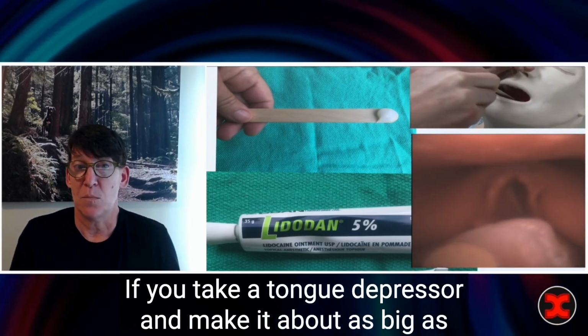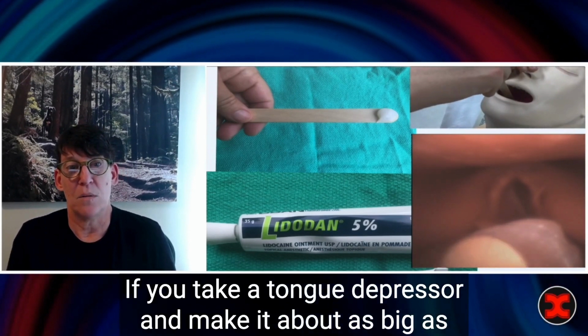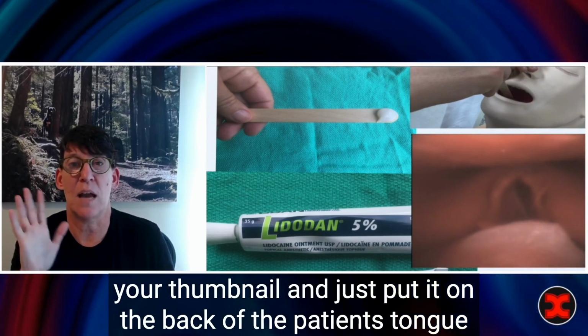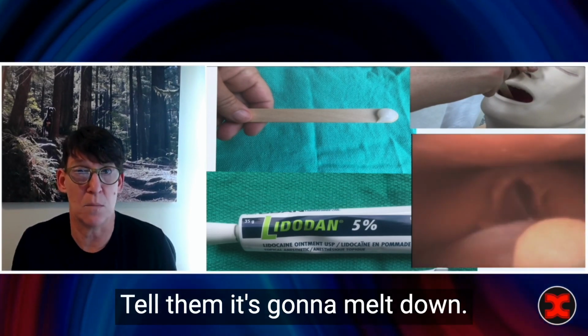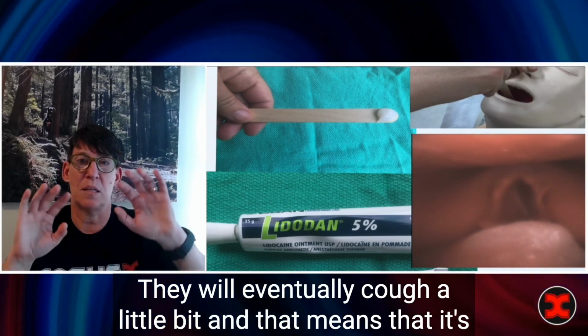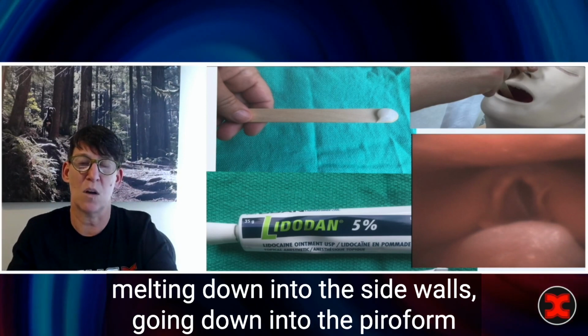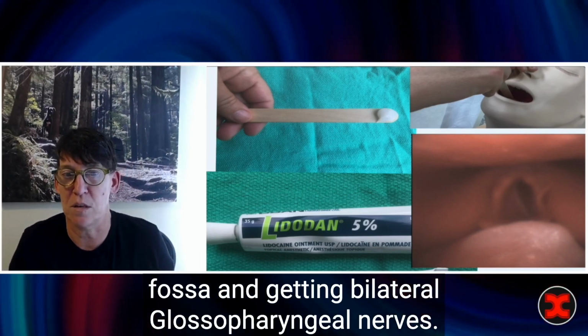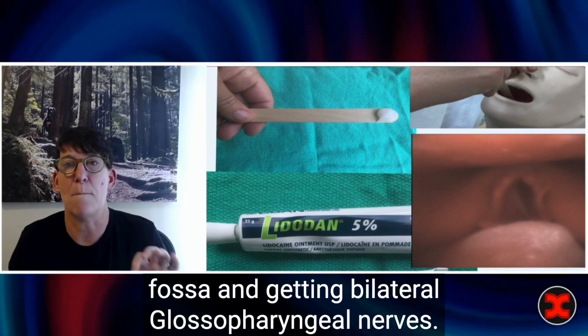If you take a tongue depressor and make it about as big as your thumbnail and just put it on the back of the patient's tongue, ask them to just leave it there, tell them it's going to melt down, they will eventually cough a little bit, and that means that it's melting down into the sidewalls, going down into the piriform fossa, and getting bilateral glossopharyngeal nerves. So this stuff is magic.